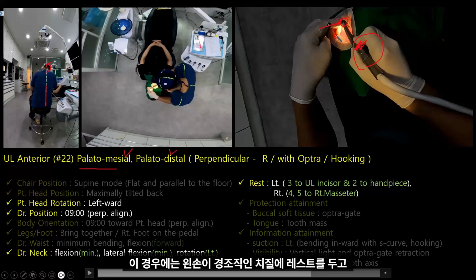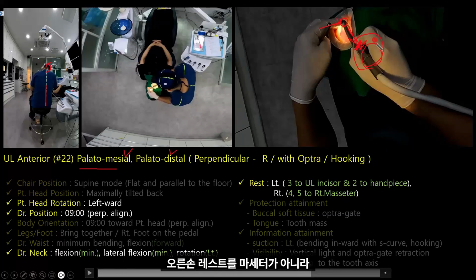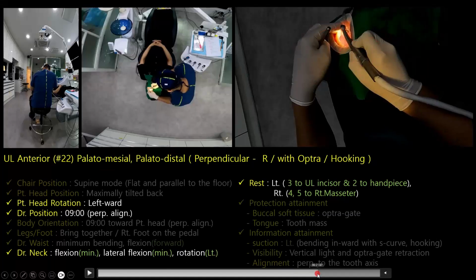In this specific case, as the left hand rests on the rigid tissue of the tooth, providing supplementary support, the right hand's rest can be positioned further from the oral cavity on the less stable, softer masseter tissue. If the left hand doesn't provide auxiliary support from a hard tissue rest, it's more balanced to hold the handpiece shorter, placing the right hand's rest on the hard tissue of the mandibular anterior teeth instead of the masseter, even if it slightly sacrifices visibility. Let's watch a brief video.